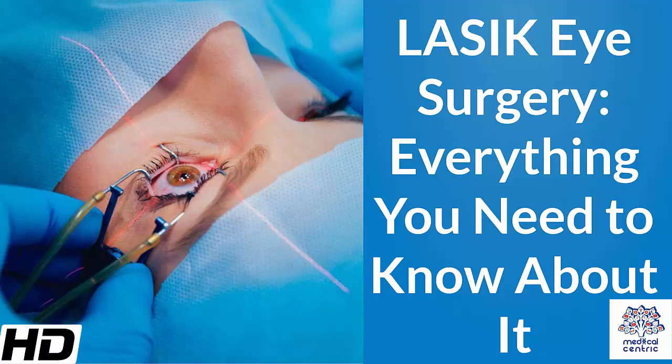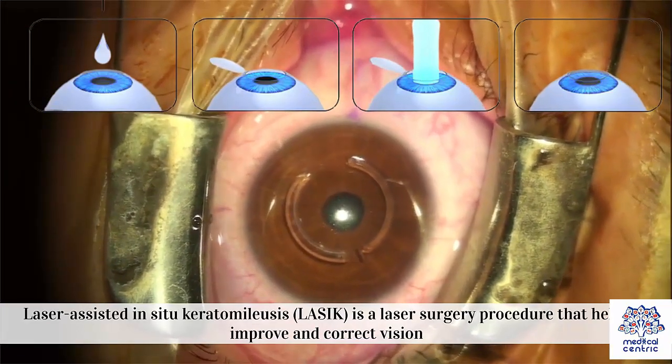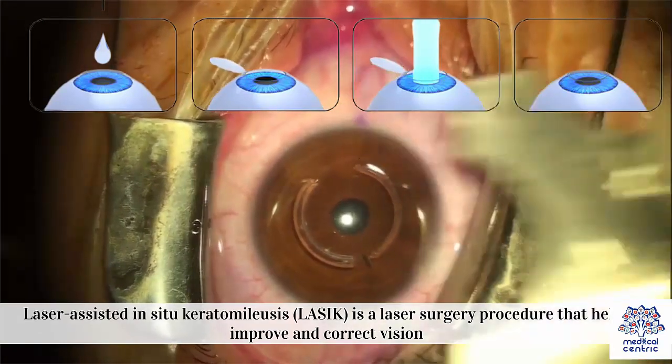Today's topic: LASIK eye surgery – everything you need to know about it. Laser-assisted in situ keratomileusis, or LASIK, is a laser surgery procedure that helps improve and correct vision.